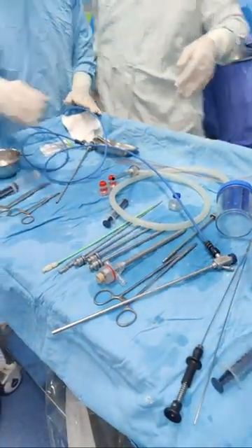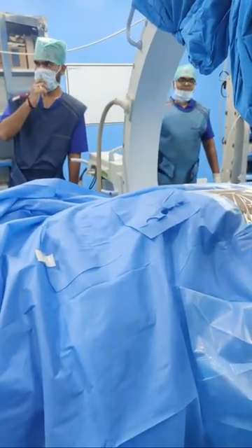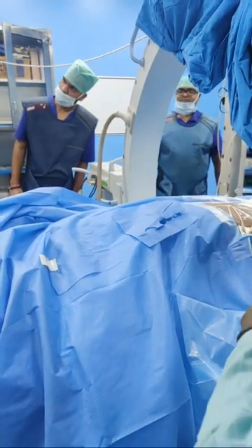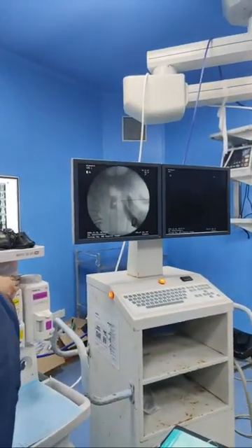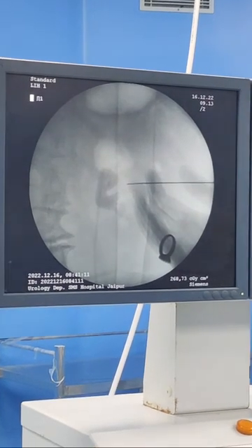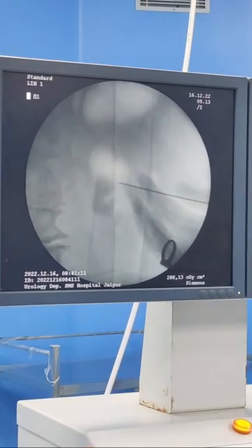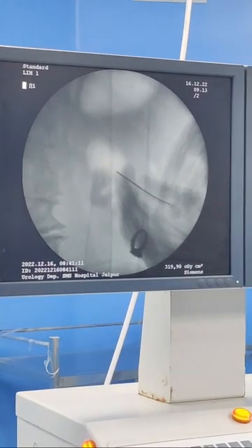Thank you. Now coming here, now he is doing a puncture. Okay, see. So this is the image, just show on the C-arm. This is the image. And what we are planning is, we have just done a pyelogram with the air. And just show the image. So here, this looks like a middle calyx, which is posterior. And we might be going through this calyx.